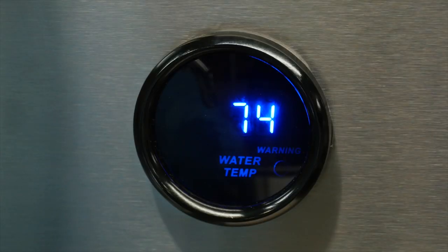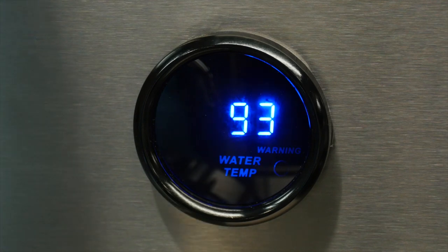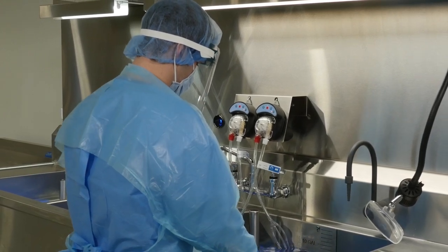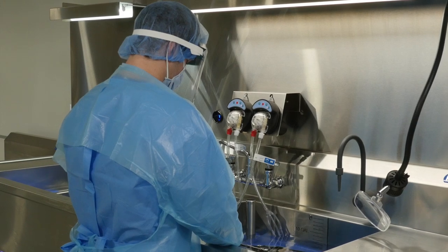The PureSteel endoscopy sink also features a temperature gauge to meet compliance for proper temperature of detergents when soaking is required. ANSI-AMY ST79 standards state that water and detergent solutions must stay in the range of 80 to 110 degrees Fahrenheit to prevent coagulation and assist in the removal of protein substances.